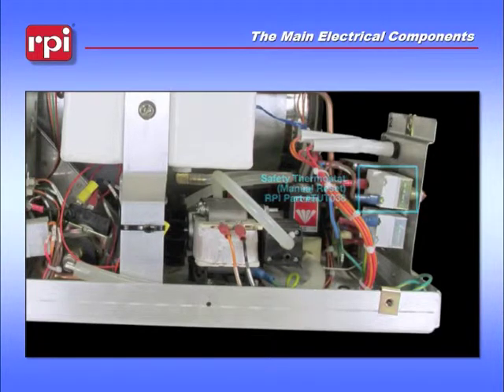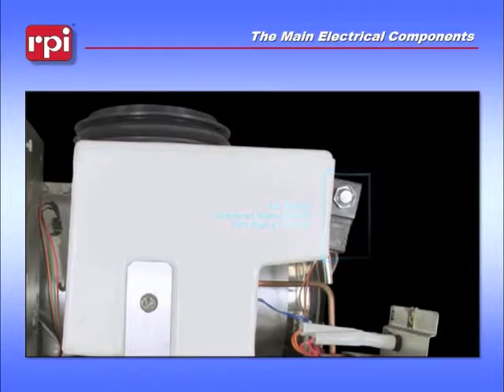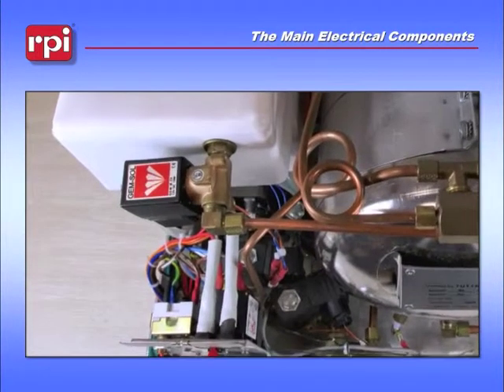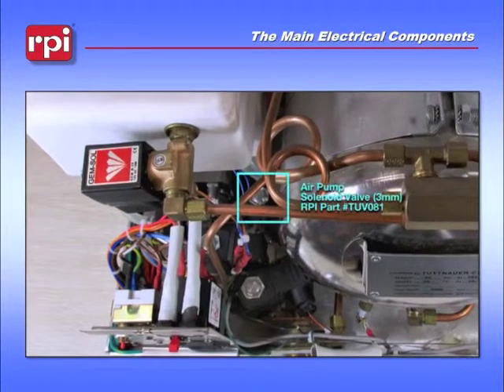Moving up to the side of the reservoir, just off the back of it, is the air outlet solenoid valve. We'll take a look at the back of the unit where we'll show you the air outlet valve. And just to the right of that, underneath some of the coils, you will see the air pump solenoid or air compressor solenoid.